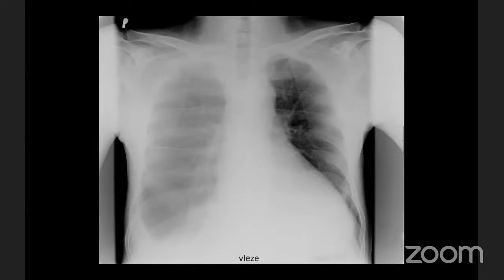On the left lung, there is this line, and it looks like the line that we would see on a pneumothorax. This one. Yeah, great, thank you. That's a really common thing. Can someone tell me what this line is? The medial border. Scapular line. Scapula, yes. Thank you. This is totally normal. Don't be shy. That's a great question.